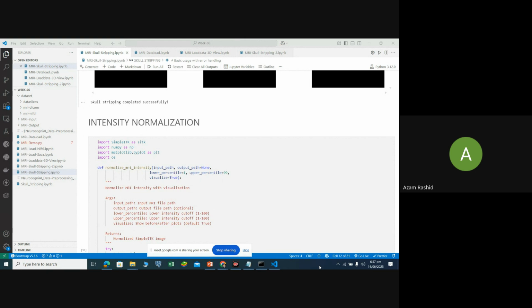In the current way, doctors apply all the things manually. They upload the MRI and apply some triggers, and sometimes the triggers are not properly applied. In our case, the whole system is automatic. The doctor just applies some check boxes, and everything is fine-tuned accordingly, because we apply different hybrid techniques.